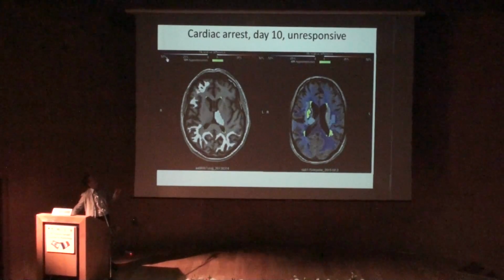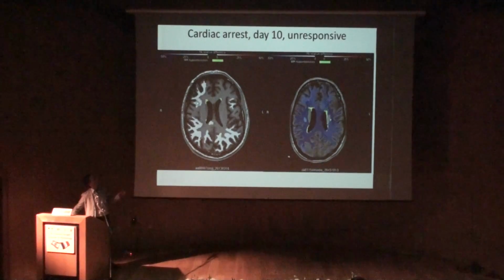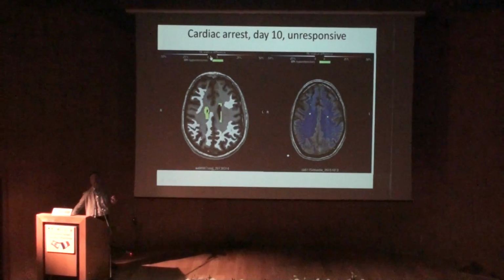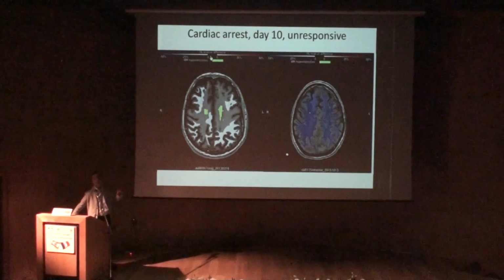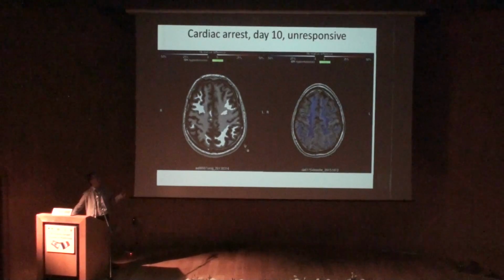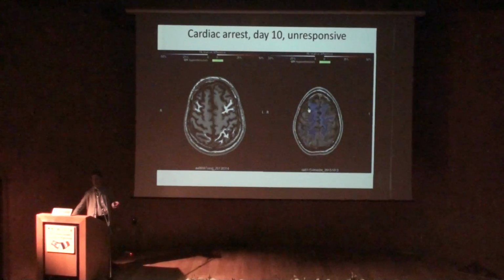The bluest is minus 50%. The light blue are around a few percent. So this guy had a few percentage points of white matter loss in the watershed territory, but that's pretty old. This one has a huge destruction of the whole white matter.